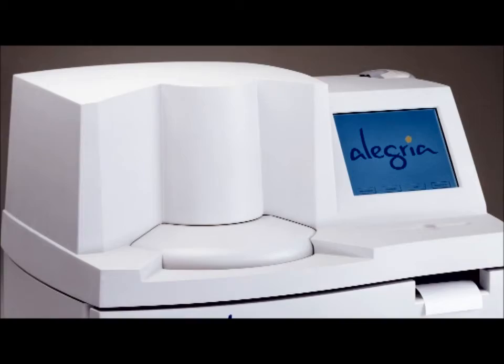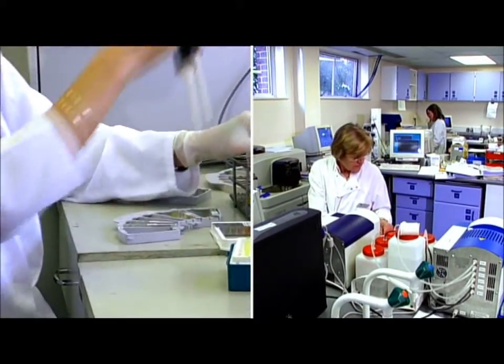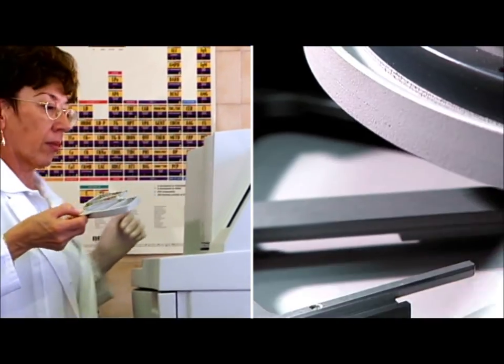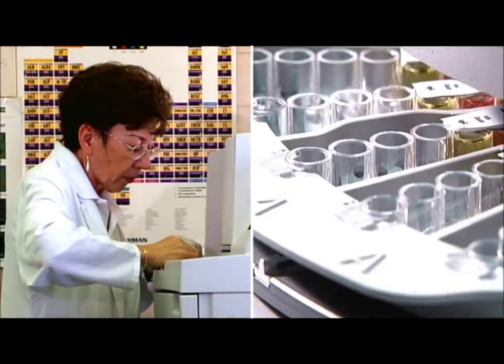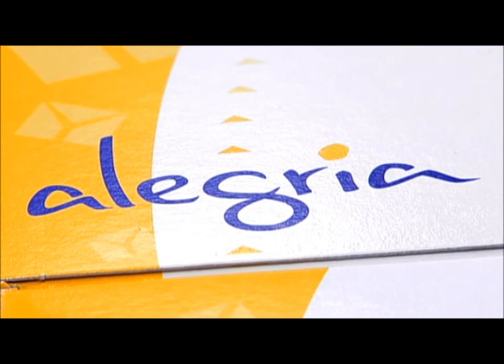The monitoring of precise time sequences and fully automated work steps ensure that stable and reproducible testing conditions are established at all times. For the user, Allegria provides maximum flexibility in autoimmune disease diagnostics. Using Allegria, a lab can get up to 30 different results in a maximum of only 90 minutes. In addition to the existing test systems, Orgentech will offer its entire product portfolio on the Allegria.